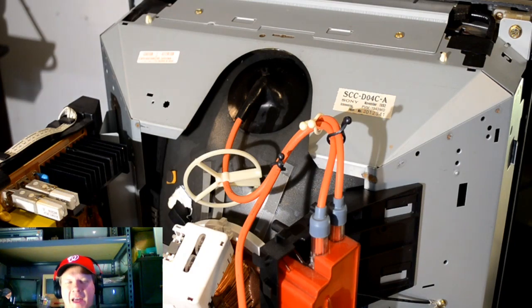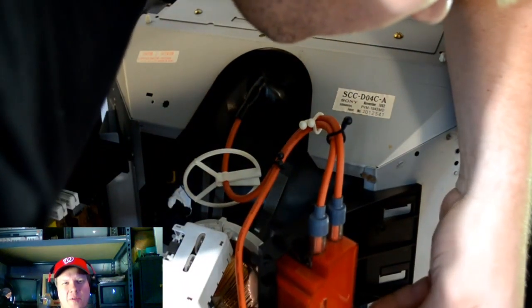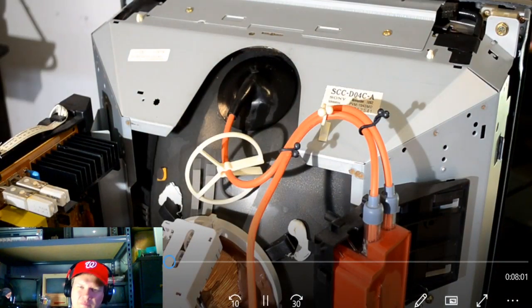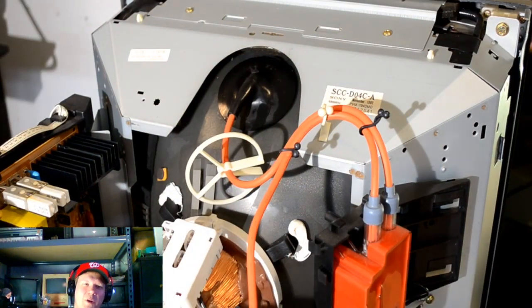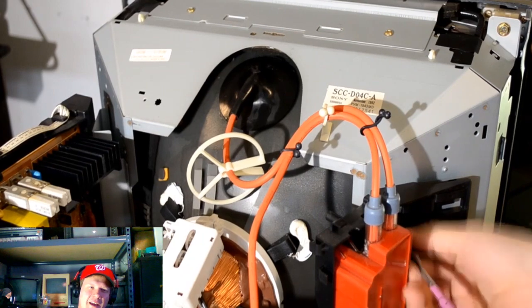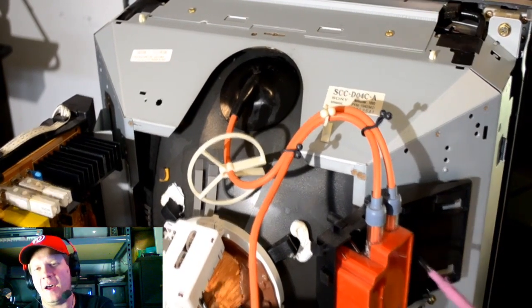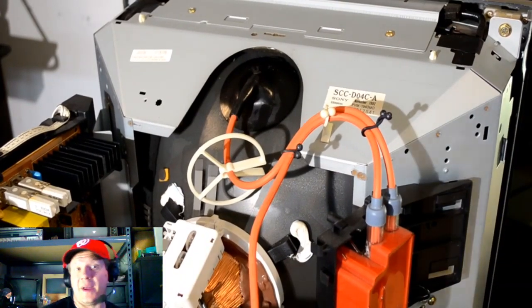But the last thing I did was I did put this little red thing on the wrong side over here. I needed to get a little further away from the neck of the CRT and everything. But all in all, that probably took me about 20 minutes to put the thing back together, even after this time-lapse video shows it sped up. It was quite complex to put it back together.